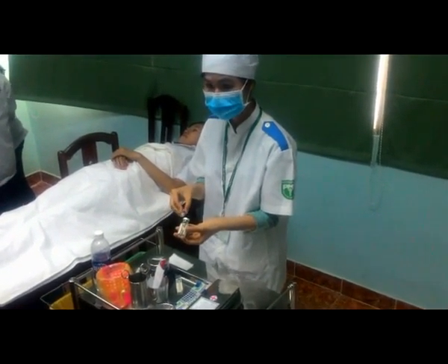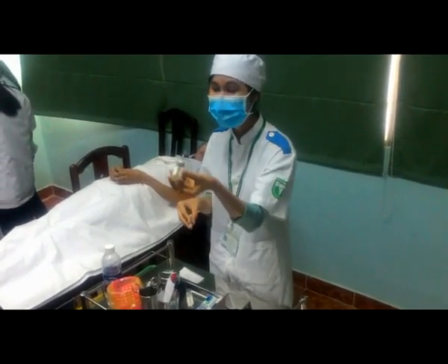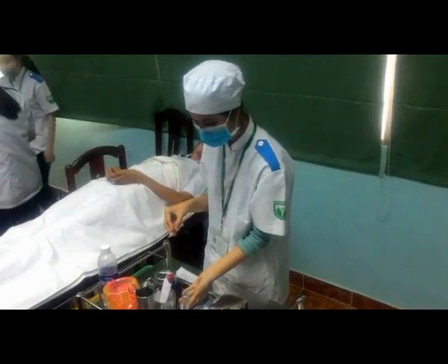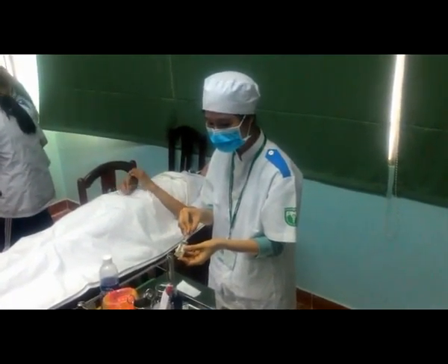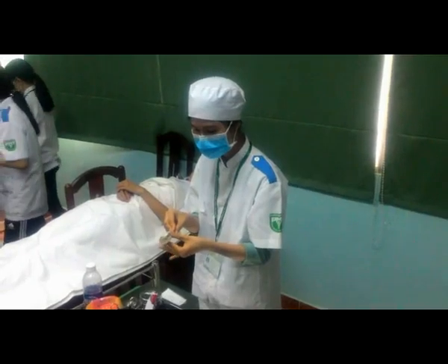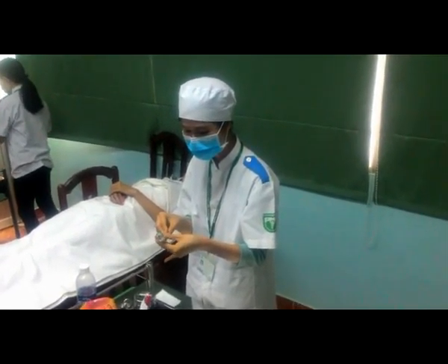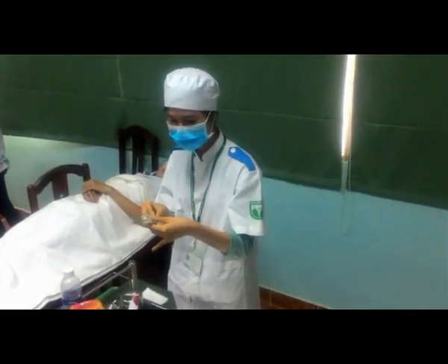Đọc nhãn thuốc trước khi bơm nước cất vào lọ thuốc. Bơm hết nước cất vào lọ thuốc. Lưu ý: bơm vào bao nhiêu ml nước cất thì lấy ra bấy nhiêu ml khí để cân bằng áp lực trong lọ thuốc.